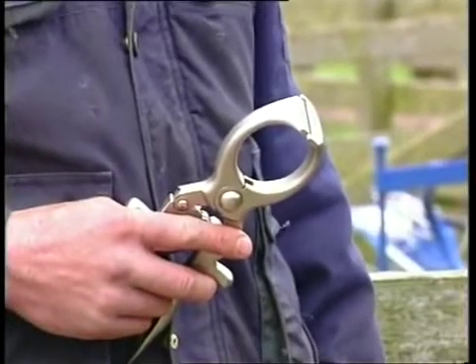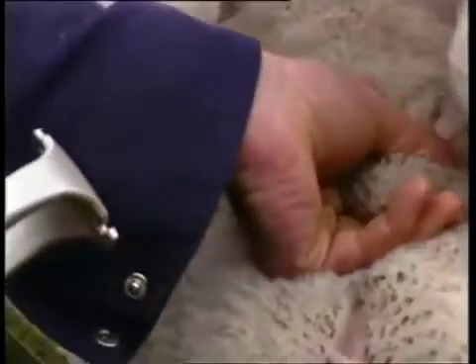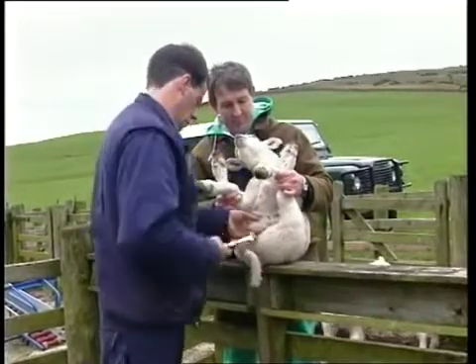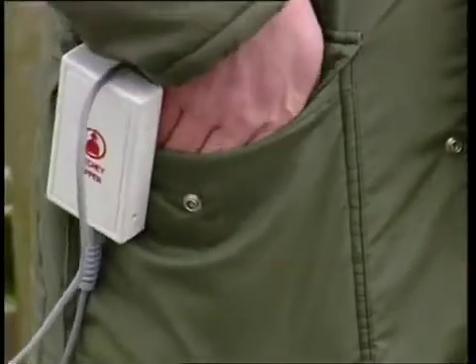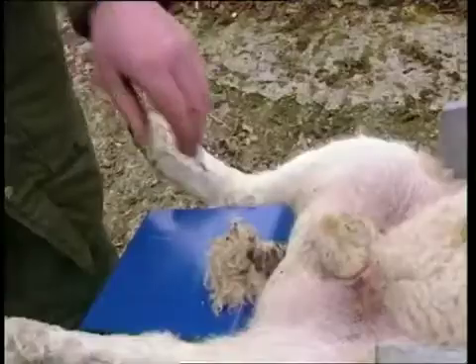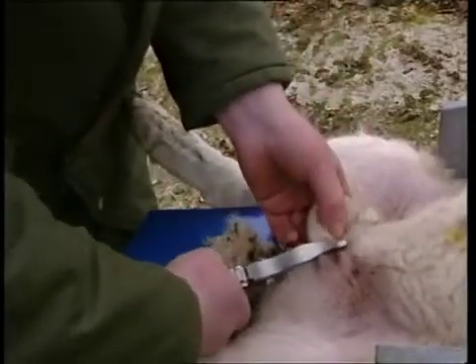The most common piece of equipment used for this method was, until recently, the Burdizo emasculator. However, farmers often found the lamb version difficult to use owing to a lack of room between the jaws. Following a study funded by the Meat and Livestock Commission, researchers at SAC developed an improved bloodless emasculator now known as the Ritchie Nipper. Users find it easier to position, the procedure is around 25% quicker, it minimizes damage to the scrotum, and it can also be used single-handed.